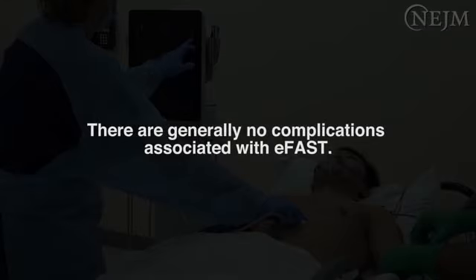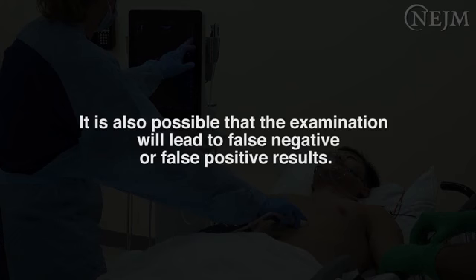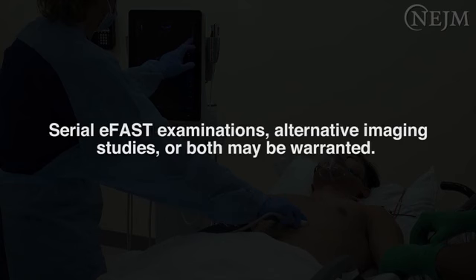There are generally no complications associated with EFAST. However, the acquisition and interpretation of ultrasound images can be limited by several factors, including the provider's previous experience, the patient's body habitus, and the presence of gas in the bowel, peritoneum, or mediastinum. It is also possible that the examination will lead to false negative or false positive results. Serial EFAST examinations, alternative imaging studies, or both may be warranted.